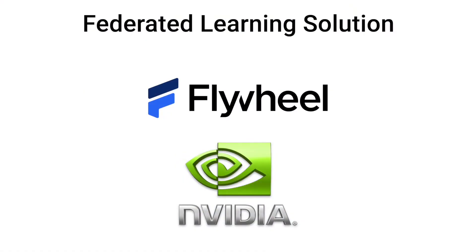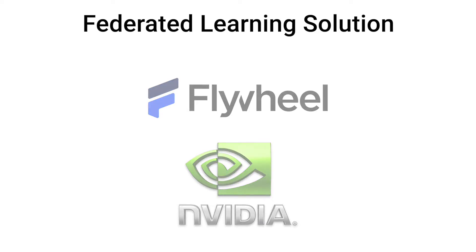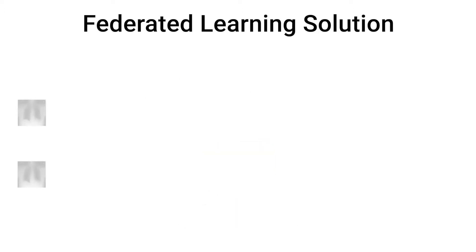Flywheel, in partnership with NVIDIA, has created a federated learning solution that will allow a centralized model to be securely and privately trained using well-curated data from multiple Flywheel sites.